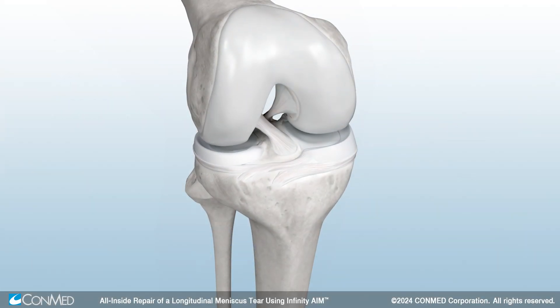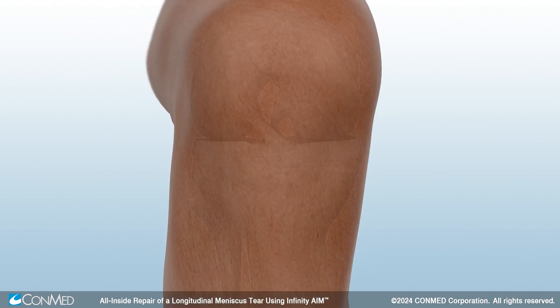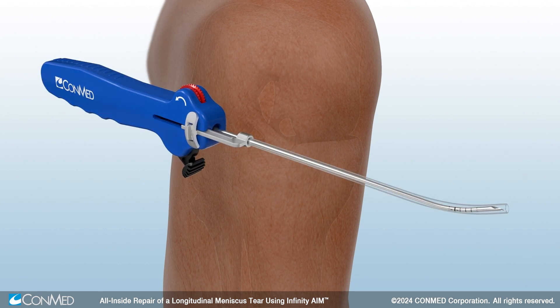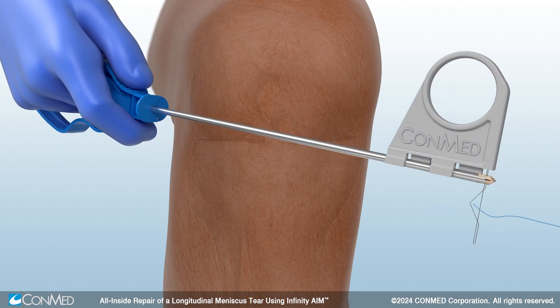This technique demonstrates an arthroscopic meniscal repair of a longitudinal with inferior vertical meniscus tear using ConMed's Infinity Aim meniscal repair device and the Infinity Aim suture cutter.